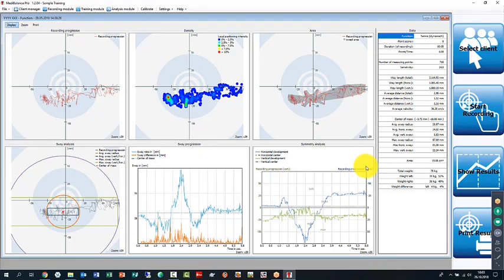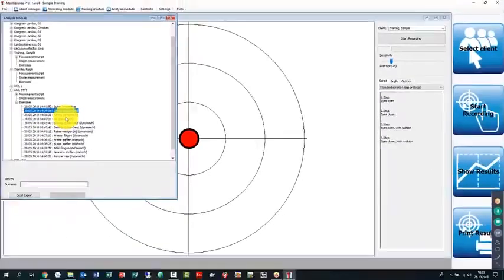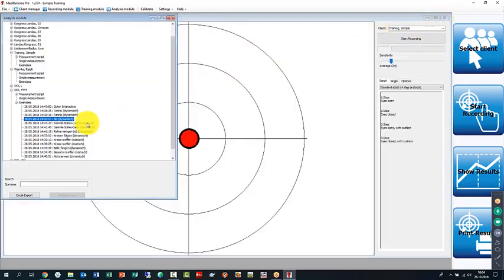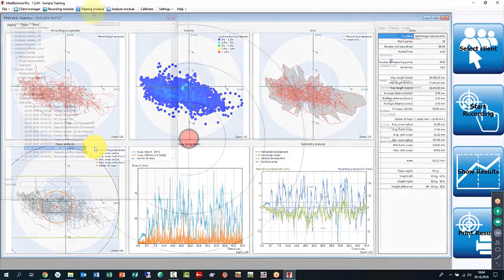So this is what you get to see likewise in here. Anything you do with the system is being recorded. And you can see for this client, for example, for the skiing, he primarily went to the front right. Now this probably was a short recording. And so I can always get an indication how well my client performed for this or that task. For example, this is catch the ball. So normally there should be a left, right, and no front back movement. And this is exactly what we see here for this analysis of a conducted training.